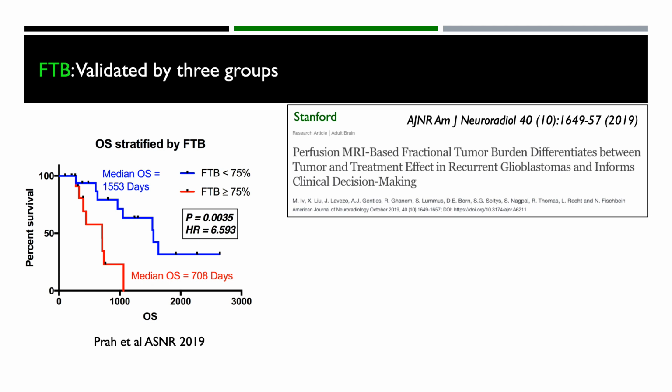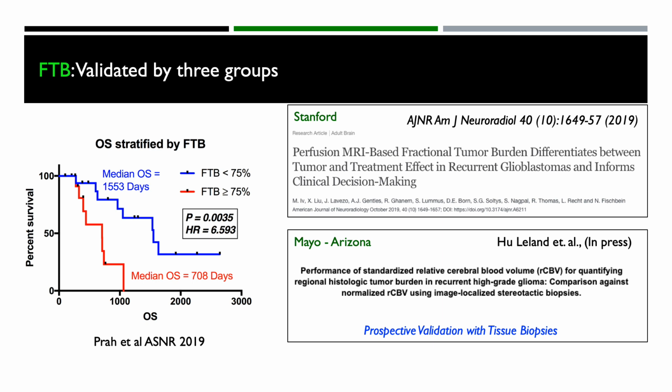Fractional tumor burdens have also been evaluated in this study performed at Stanford that also showed that it was very informative in terms of clinical decision making. And then more recently, another study was done at Mayo Clinic in Arizona to again prospectively validate with tissue biopsies the method of creating fractional tumor burden.